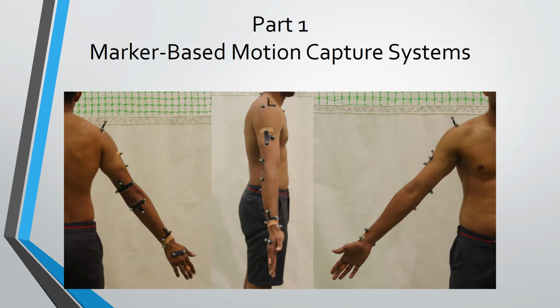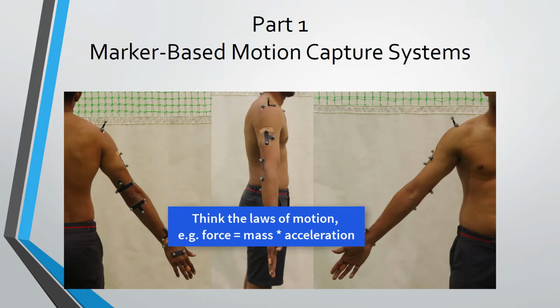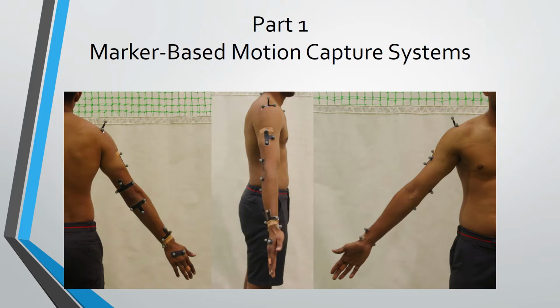So, the purpose of motion capture is to record human movement for further assessment. If we're talking about a biomechanical assessment, this implies that we're going to apply some mechanical concepts to biological systems. For example, calculating the positions of body segments, perhaps the angle between 2 segments, some relative accelerations, or even some forces acting along and through these segments.